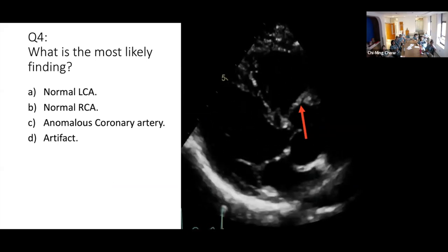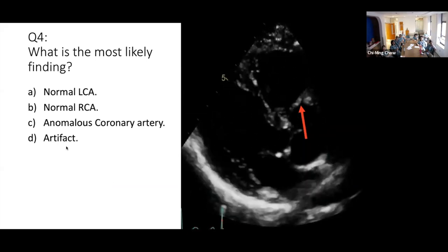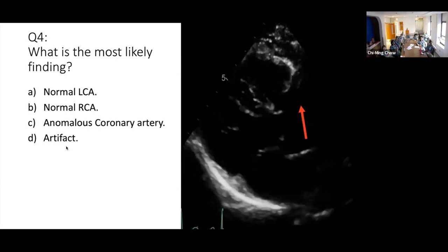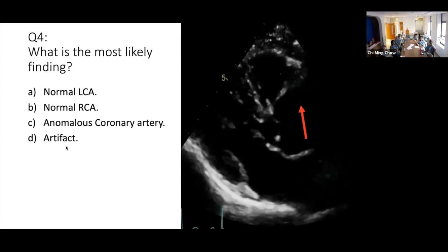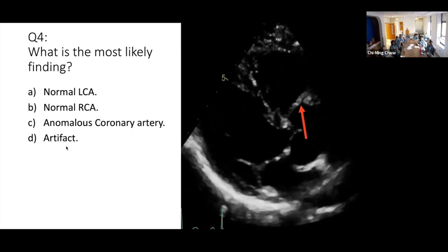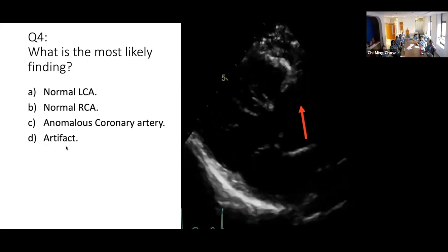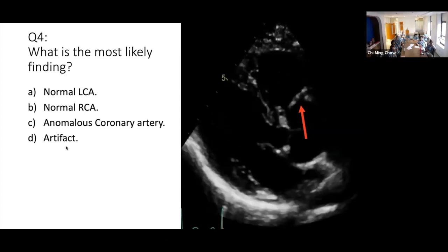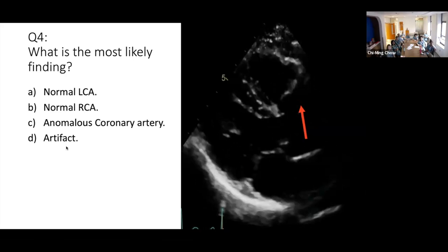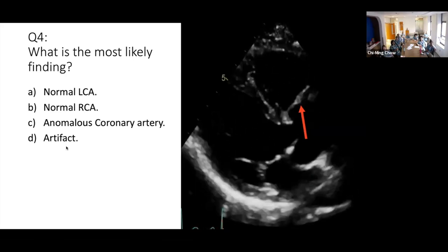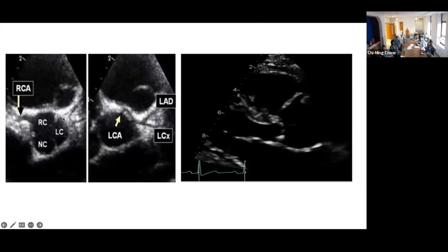What is this structure? What is the most likely finding? Is it left coronary artery, right coronary artery, anomalous coronary, or artifact? The majority said it is the right coronary artery, which is correct. You can see the coronary arteries by echo. It is more common in pediatrics where they assess the coronaries by echo to confirm normal coronaries, visualize the origin, and check for anomalies. You can see the RCA, the left main, and the bifurcation here.